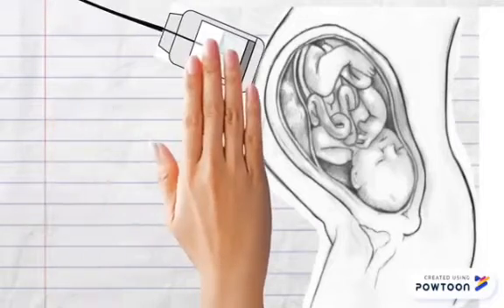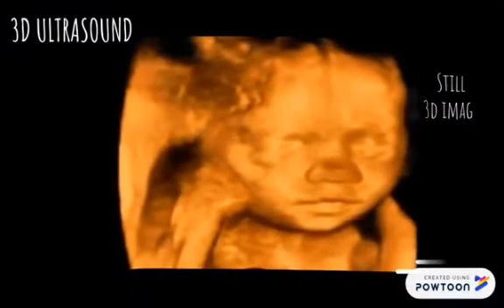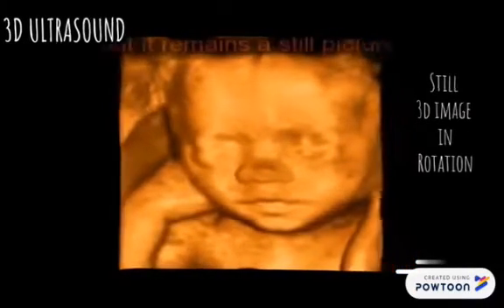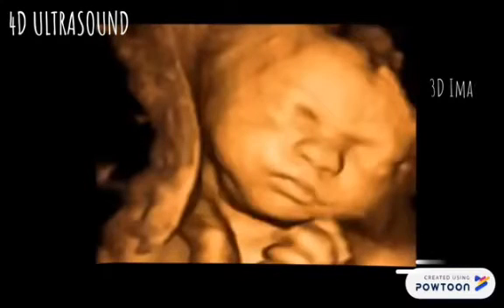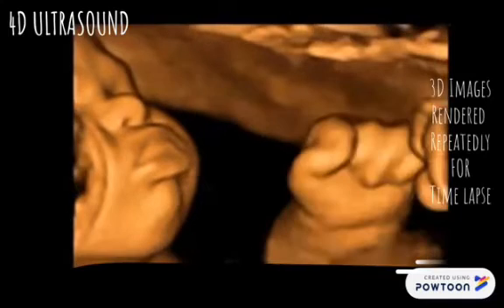3D ultrasounds use multiple emitters placed in different angles surrounding the target to produce multiple images, which are then interpreted through algorithms to create a 3D image. Similarly, 4D ultrasounds use multiple emitters to create a 3D image, except the image is then rendered repeatedly, resulting in a time-lapse of the images.